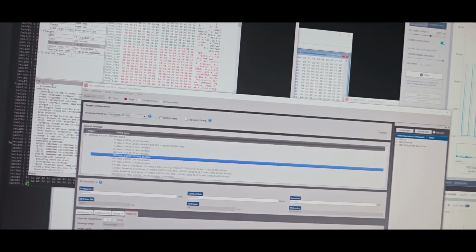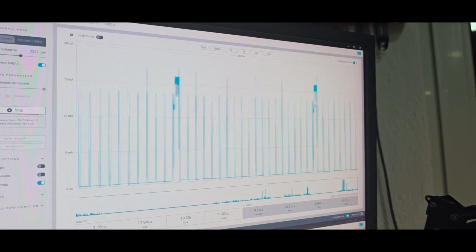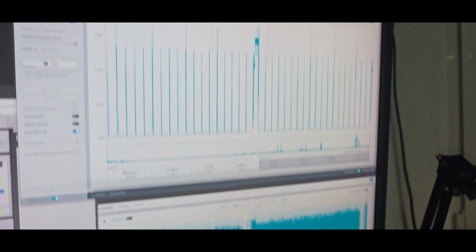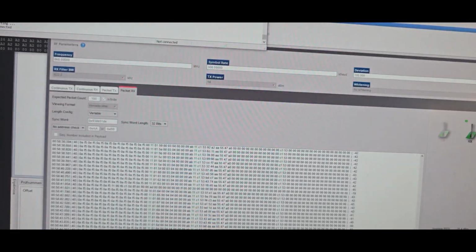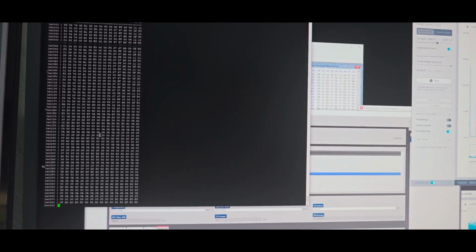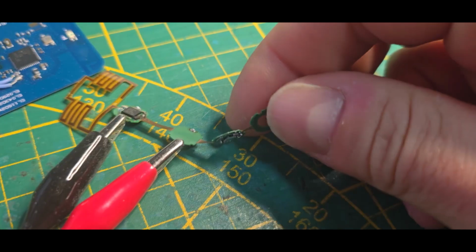But if I now just boot the custom firmware via this, you can see the camera is having a current increase every now and then. And here you can see the other SoC. What is happening now is you also see here the status info and every now and then the answer from the custom firmware. And then the camera answers with this 4 megabytes per second data of real camera data. We just now need to decode it somehow, and best would be a mini web tool to just show the image. Let's see where it goes. And yeah, after that we can also assemble it again.